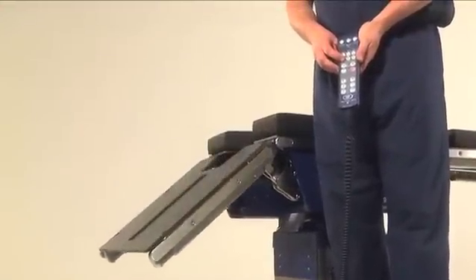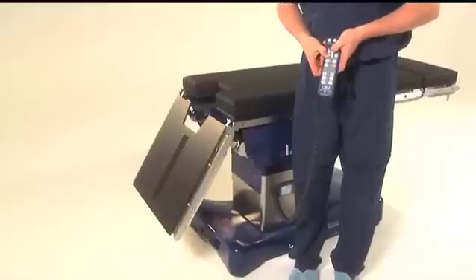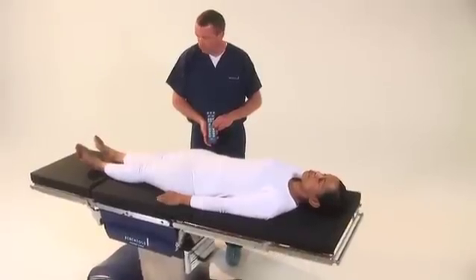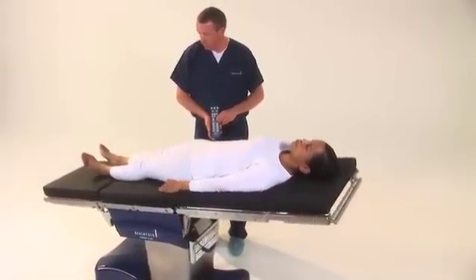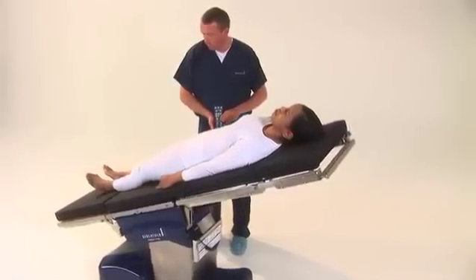For example, if the leg section is lowered to 90 degrees and the operator attempts to lower the table simultaneously, sensors will detect a potential hazard and halt the movement. The table monitors all relevant tabletop positions, including the leg section, the back section, the head section, height, Trendelenburg, reverse Trendelenburg, and tilt.